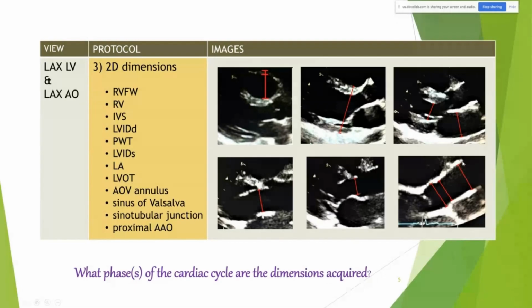Remember to start your study at the parasternal window, always around that 4th intercostal space, and you want the transducer to be turned towards the patient's right side. So ultimately, we're going to be measuring all of these before we move on. The reason why you're taking this end-diastolic measurement and the end-systolic measurement right here is so we can get what is called an ejection fraction.